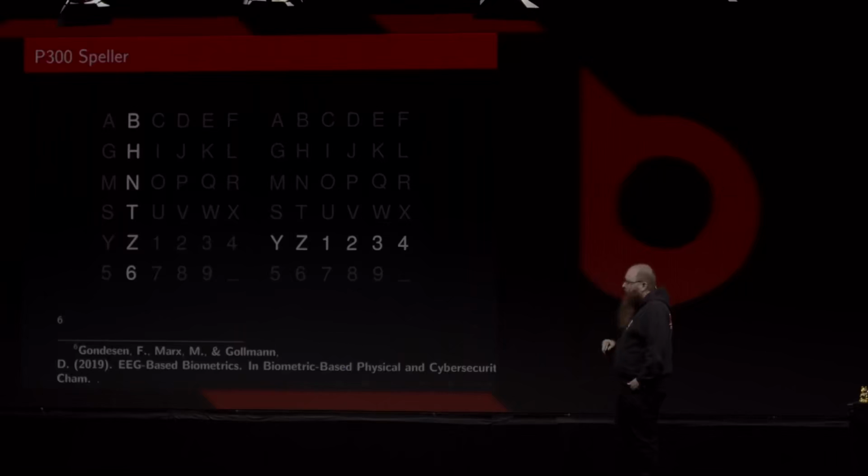For that we used the best data sets that we have that had the highest score in the cross-validation. It still works. The interesting thing here is that the classification of the EEG data is possible without tuning the classifier to the user, making the system non-biometric.